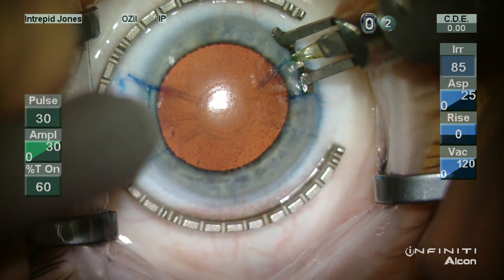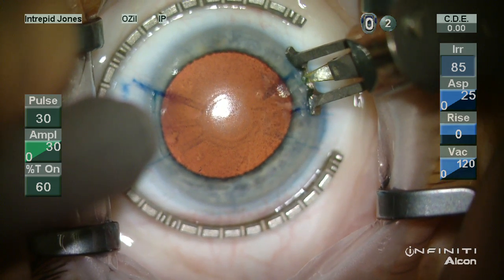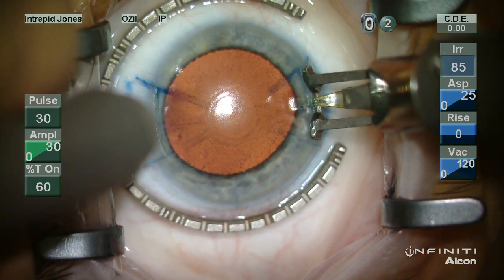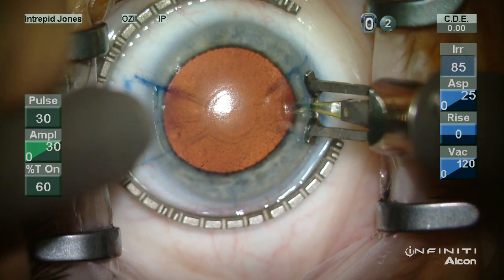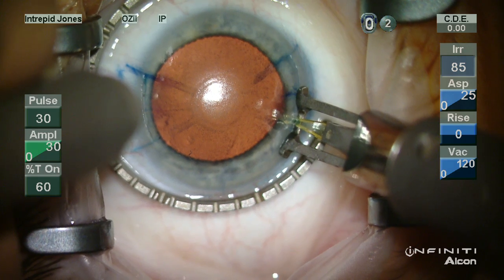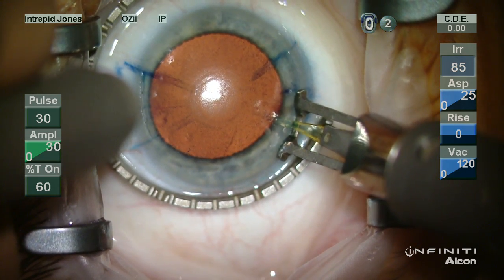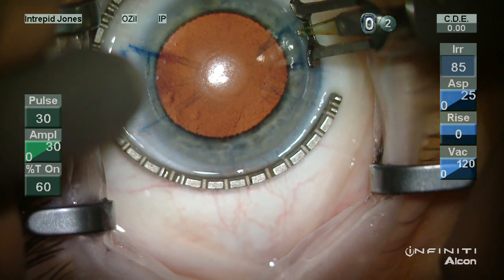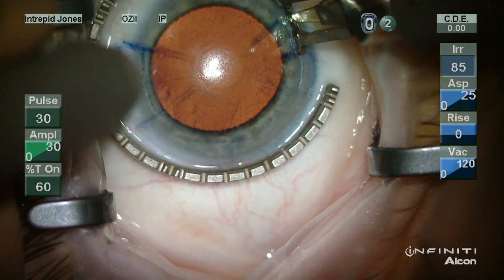Once again you plunge the blade in, drawing the blade towards the surgeon with a slight rotational movement. I tend to find that the epithelium is usually loose on one side and not both, although this can occur on both sides, so it's good to be aware of this potential issue.